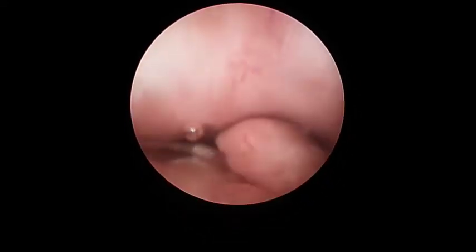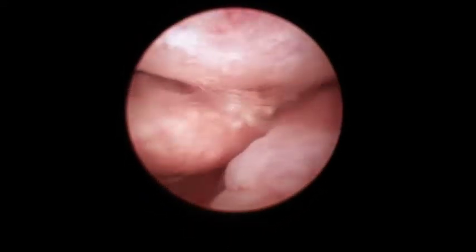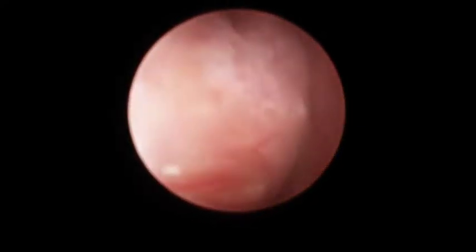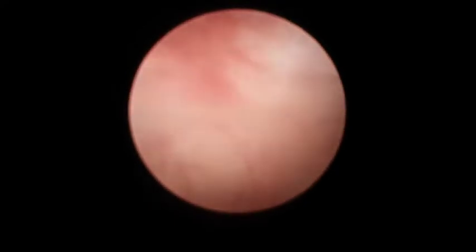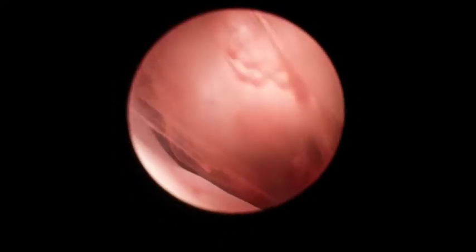A 6.25 mm outer sheath 0-degree hysteroscope was introduced through the cervix after dilatation. Examining the uterine cavity reveals a large, 4 cm anterior fibroid, grade 0, as a stalk can be visualized. The myoma encompasses close to the entirety of the uterine cavity. The decision is made to go ahead with the procedure as booked.